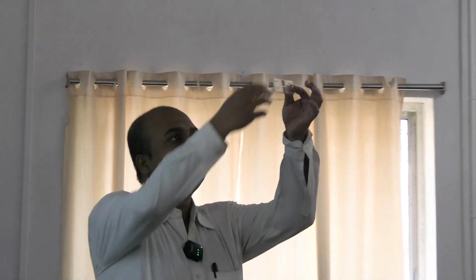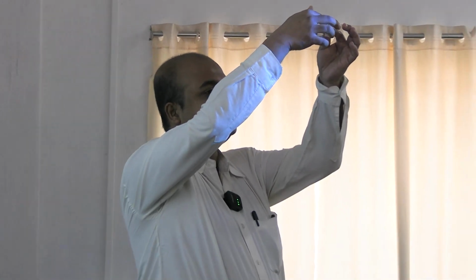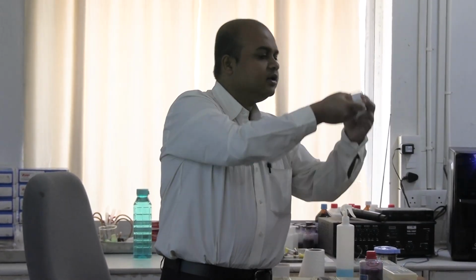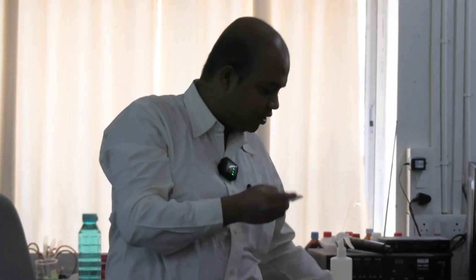This is the Neubauer's chamber, the upper part and the lower part, with a horizontal groove above, two identical counting chambers. We can count in any of them. Ideally, count in both and take the average, though we are talking of uniform distribution during charging the chamber. Over this chamber, a cover slip will be put, and in between the cover slip and the counting grid, the blood will be charged.